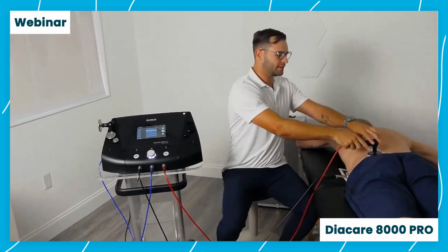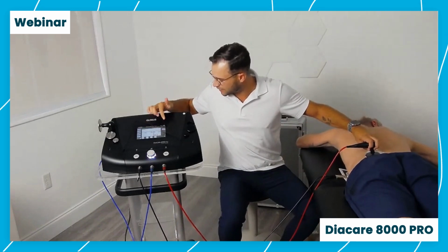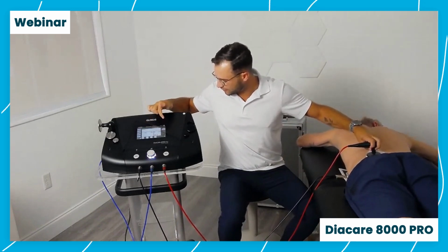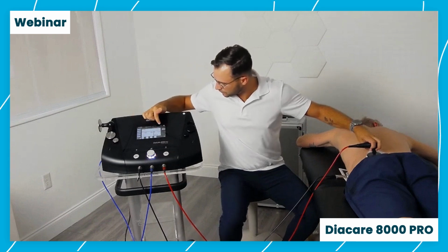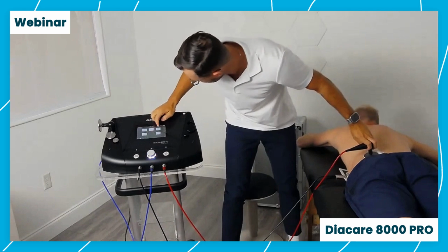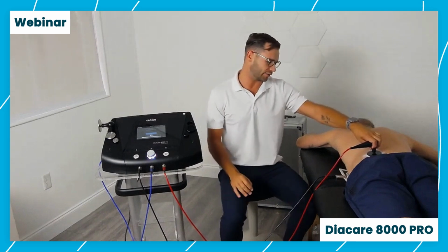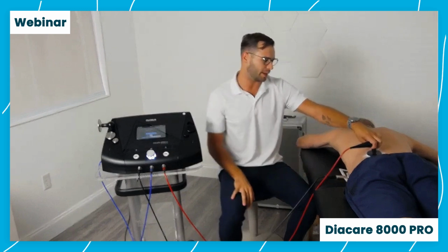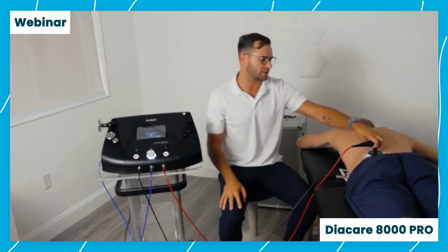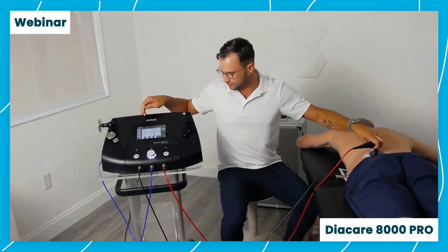So once the head of the active electrode is placed on the body, the important thing we're going to do is we're going to calibrate. What is calibration for a TECAR machine or for the Diacare specifically? When we calibrate, we go ahead and start, and it's measuring the impedance of your patient's body. So this is going from the return plate to the active electrode, and we're making sure that there's not going to be any zips or charges throughout the body. So we're protecting the patient, making sure they're very comfortable.